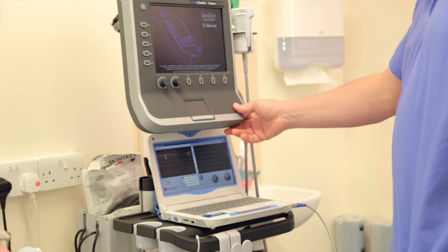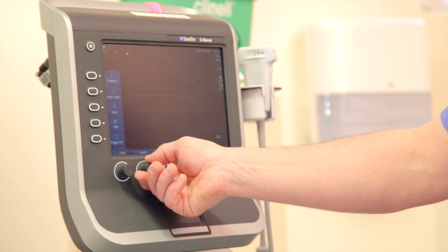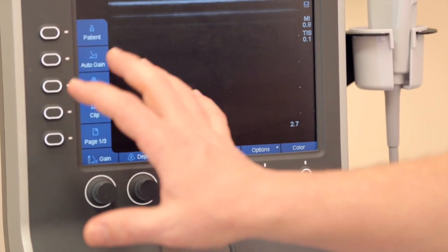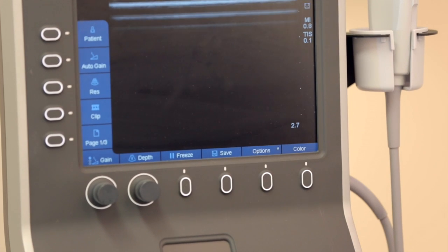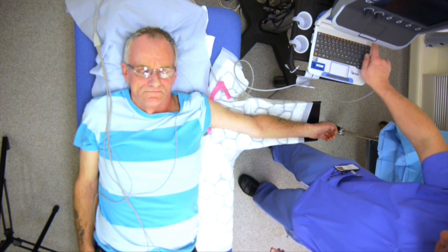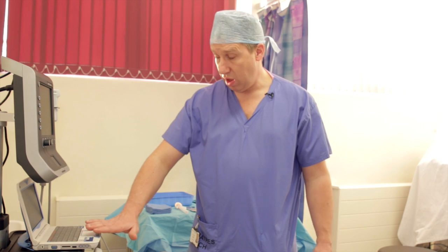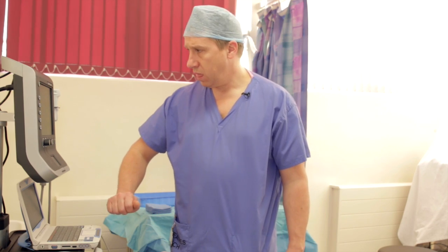Setting up the ultrasound before scrubbing. I normally start with a default depth of 2.7 centimetres and change the preset to a resolution-oriented view. I like the screen slightly brighter than average, so I turn the gain up a little. I essentially do this procedure single-handed. I also make sure the mouse is hovering over the freeze button on the Nautilus, so I can freeze the image using a piece of gauze over the keypad without desterilizing myself.